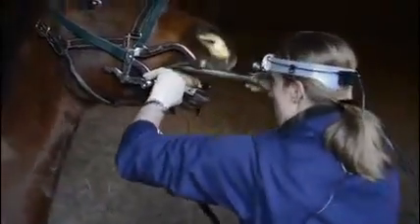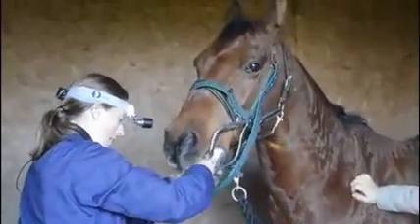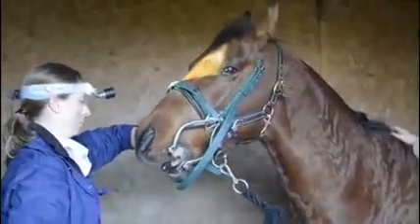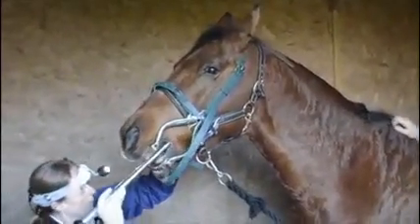His roots will start to narrow in the next 5-10 years. A little bit more on that side. We'll just concentrate on the lowers first and then we'll do the uppers.